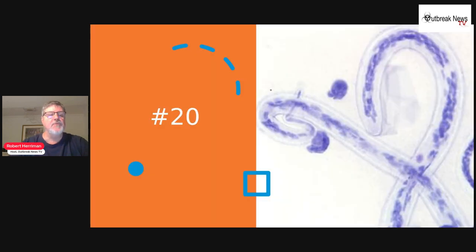And I'm going to close with number 20. And let's give a description. This stage of the parasite is sheathed, measures 230 to 250 microns long in stained blood smears. The tail is tapered and nuclei extend to the tip of the tail. What do you think it is?